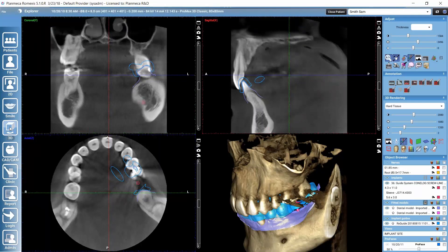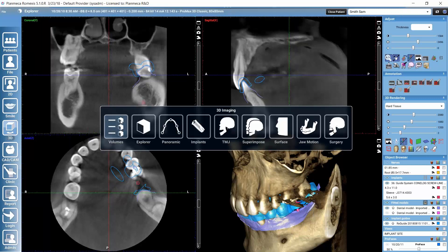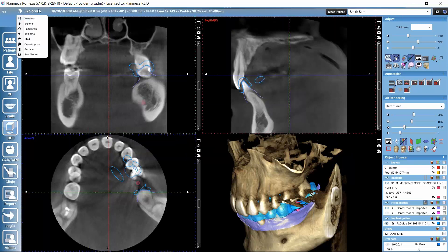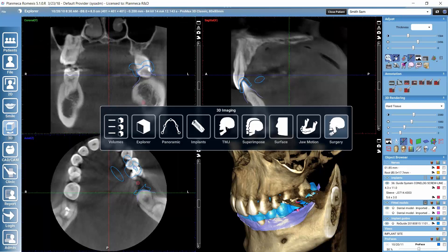We have several submodules in the 3D imaging module. We can get the different submodules visible by clicking on the module icon, which works as navigation between them. Another navigation option is here — if we click on the Explorer text or whichever submodule we are currently in, we get a dropdown of different submodules available. If you don't have all of these visible in your RomeXis, that's because of your license — this selection depends on the kind of license you have for RomeXis.